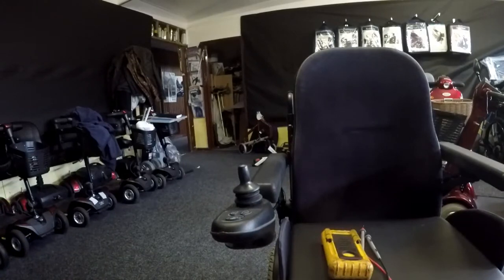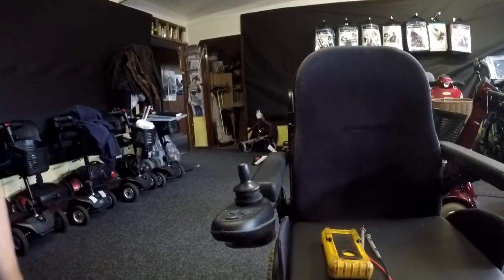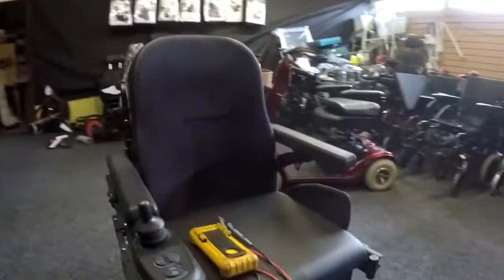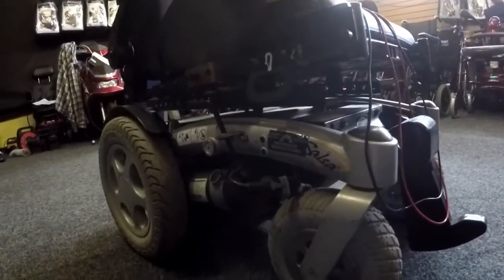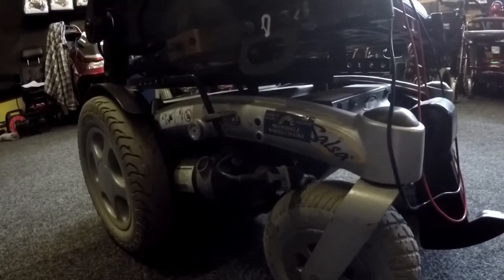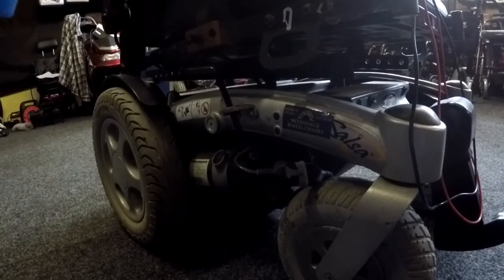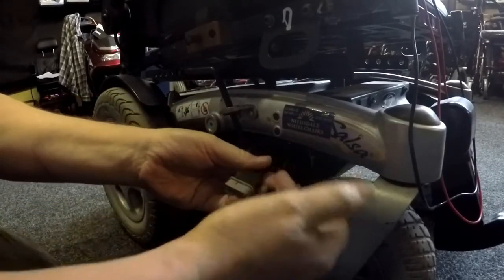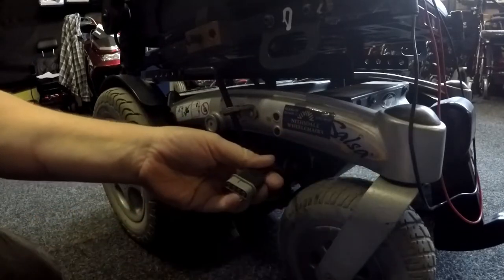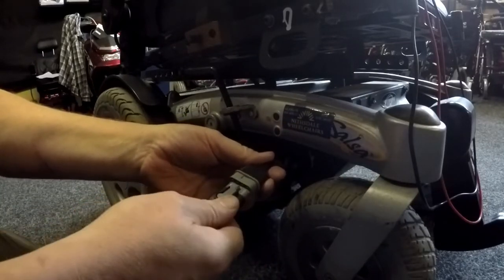So to find out if it's a faulty VR2, we're going to insert the side here, the control box. Okay, I'll come in close a wee bit so you can see that there. So what I'm going to do is pull it apart. This is just a short extension cable to the power module, which is hidden behind a plastic cover. So we're just going to plug this in here.